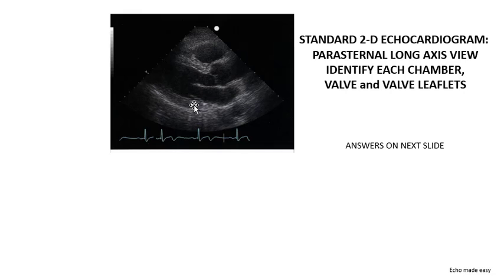Your orientation is important. Your right ventricle sits above your left ventricle, and your aorta sits in between, and this is clearly identifiable, hopefully, as the aortic valve. You will become familiar with these names. It's expected of you. And in relating this to the patient, this is the tail of the patient, of the feet, and this is the head of the patient. So you'll be able to interpret this in terms of anterior and posterior and superior and inferior. Let's have a look at the answers on the next slide, except to point out it's not very clear here. This would be the aorta.